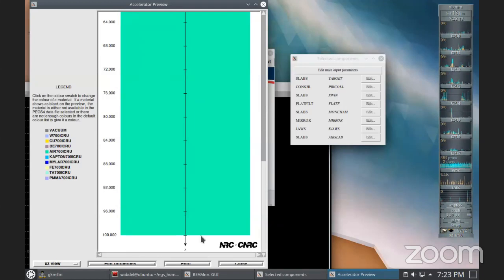Optimization means that we have a model, but how well does that model represent or match the actual beam in your clinic? So what you do is run the simulations, take the phase-space file and use it as an input, let's say in a DOSXYZ calculation. From the DOSXYZ calculation you get your PDDs and your profiles, and you see how well these simulated data match your measurements.